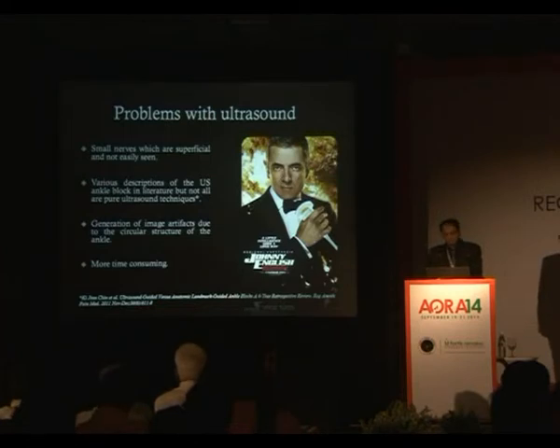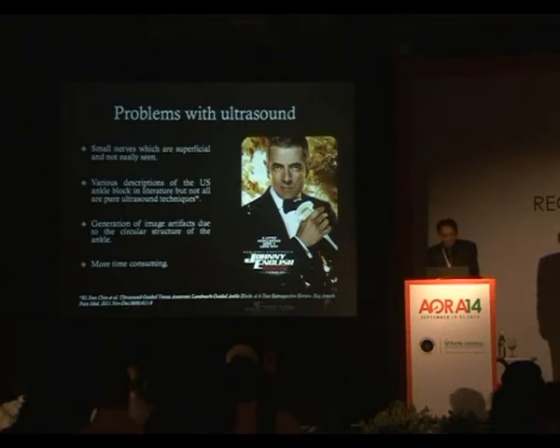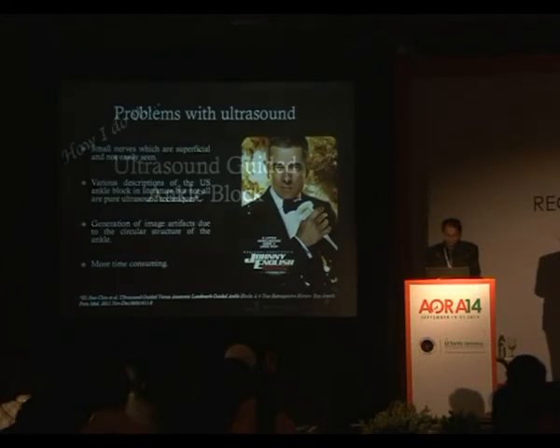The ankle is a fairly compact and circular structure, and our probes are usually anywhere from 25 millimeters if you have the small probes, but on average everybody has the 38 millimeter or the 50 millimeter probes. These don't sit very well and don't make good contact with the ankle, so you get a lot of artifacts. It's not too much of a concern. The other thing is, no matter how quick you think you are, it's going to be quicker to do an ankle block with the landmark technique as opposed to the ultrasound technique. The ultrasound technique does take a little bit of time. Whether you can work around it remains to be seen.